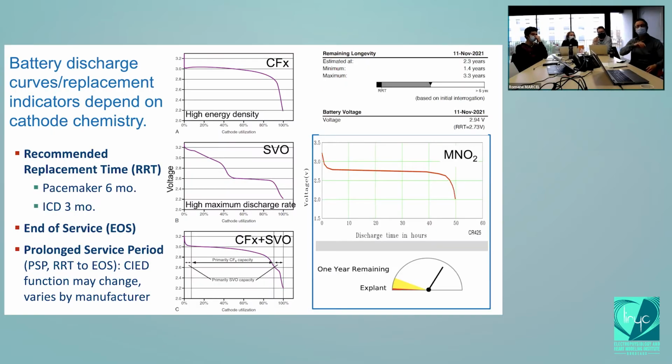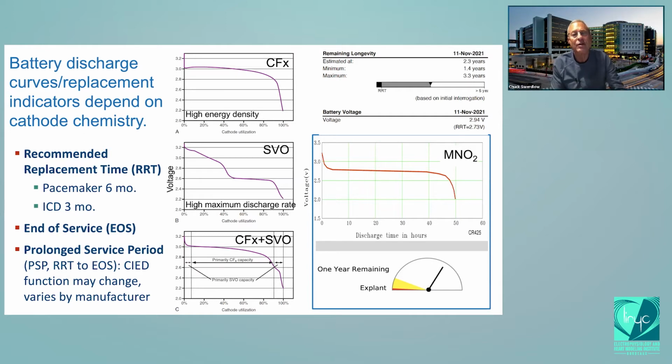From the previous graphs, is it possible to deduce the energy density and the maximum discharge rate based on those graphs purely? No, this is only voltage. Right, this is only the voltage. It does not, and this is, as you see, just percent. You cannot tell those.